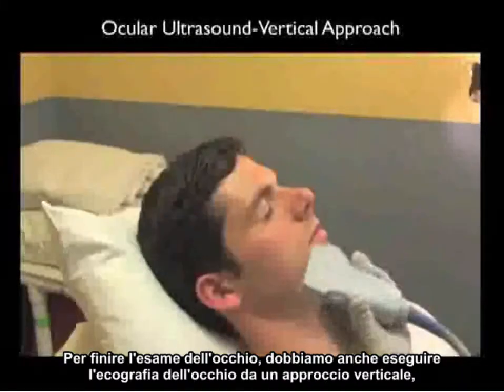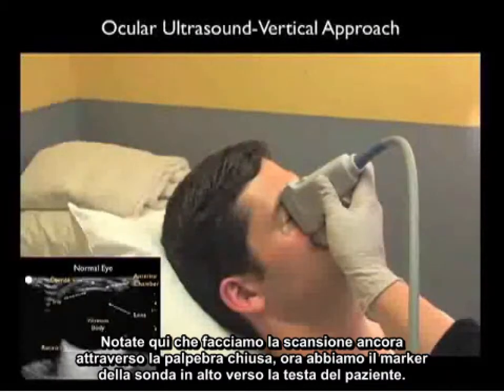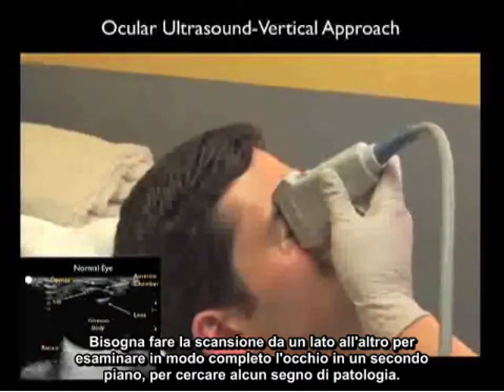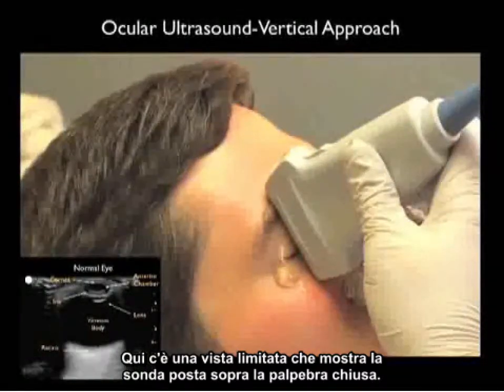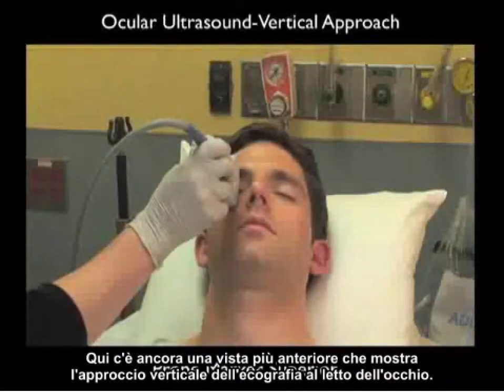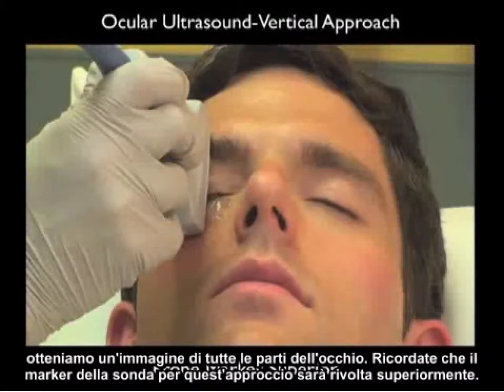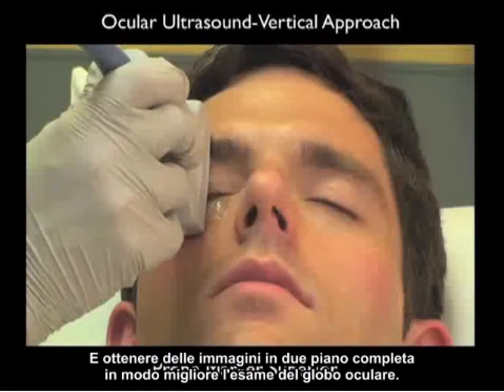To complete our examination of the eye, we should also perform ocular ultrasound from the vertical approach, having the probe in an up-and-down configuration. Note here we're again scanning through the closed eyelid, with the probe marker up towards the patient's head. We want to scan from side to side to fully investigate the eye in a second plane for any signs of pathology. Here's a closed-in view showing the probe placed over the closed eyelid. Note the high-frequency probe placed over the closed eyelid; scanning from side to side will image all parts of the eye. Remember that the probe marker for this vertical approach is oriented superiorly, and imaging in two planes will best round out the examination of the eyeball.